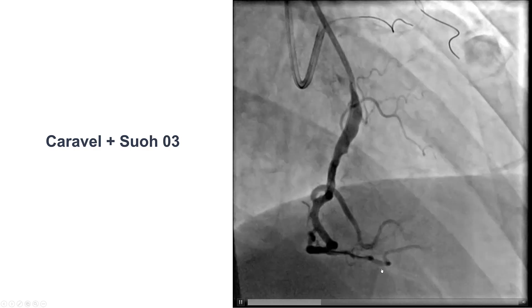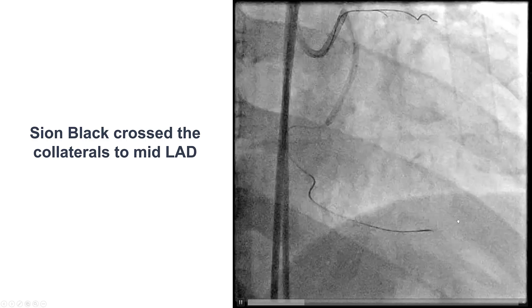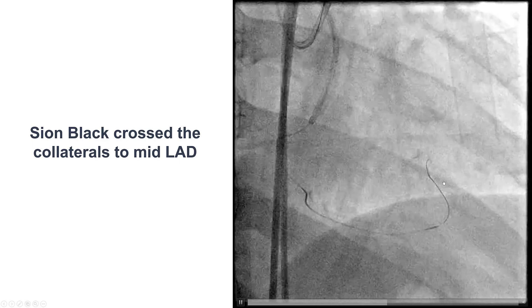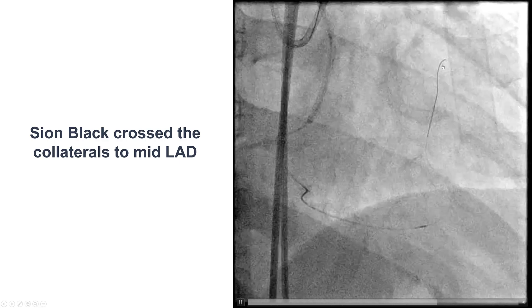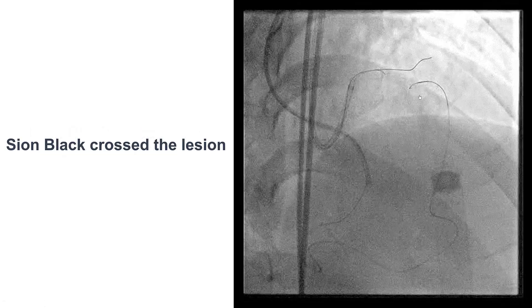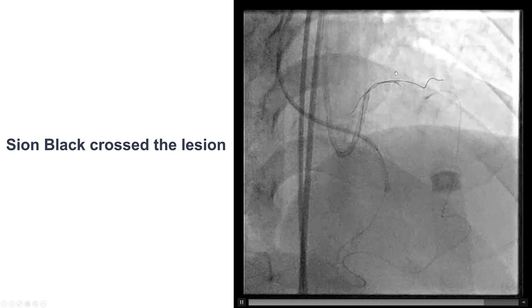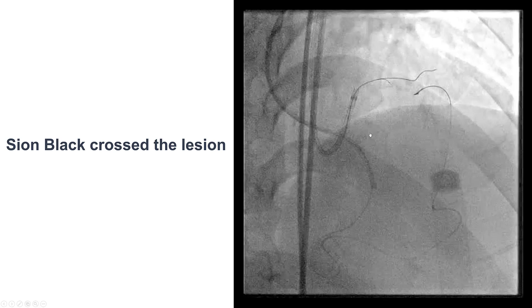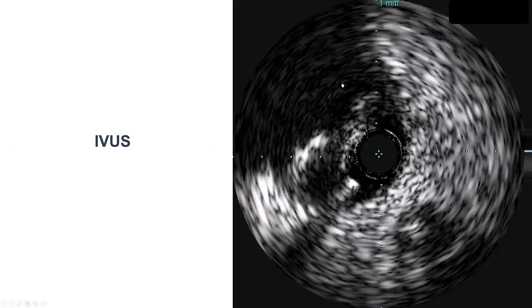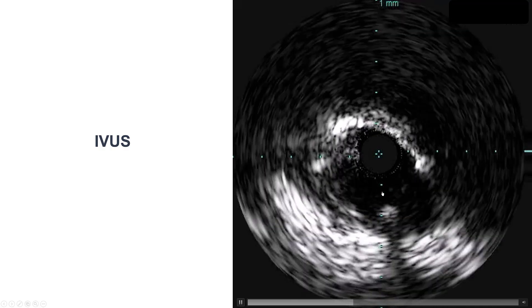A Caravel microcatheter along with a Suoh 03 guidewire was used, and then changed to a Sion Black, which went fairly smoothly through the septal collateral and made it all the way up to the left anterior descending artery. After delivering the Caravel, we were able to advance the Sion Black wire fairly easily into what appeared to be the proximal true lumen, which was confirmed by intravascular ultrasound showing the retrograde guidewire was indeed in the true lumen.